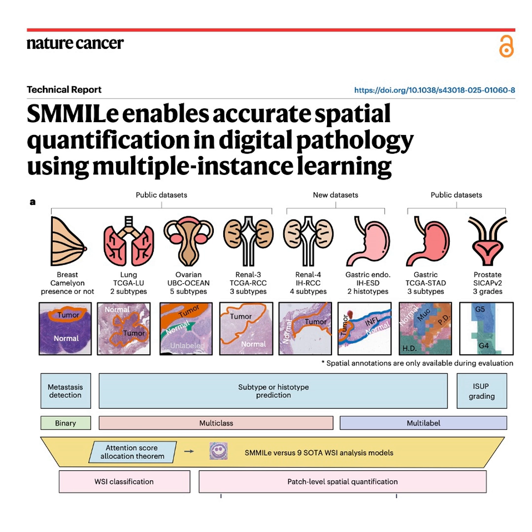So quick recap. Pre-processing shrinks and groups the image into superpatches. Dropout hides the obvious clues. Sampling mixes the data. Consistency learns the normal baseline. And MRF peer pressures the map into spatial smoothness.